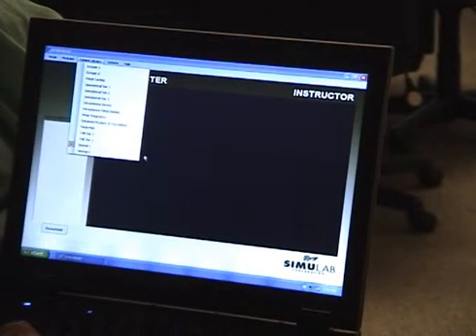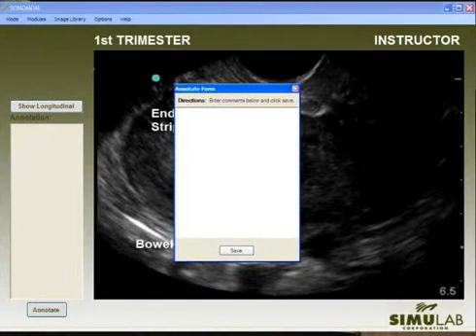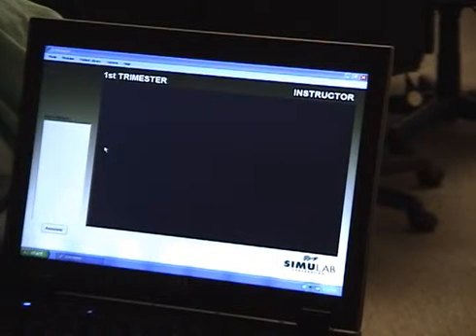You'll notice down in this area here we have an annotation mode. That allows the teacher to actually type in different descriptions or potentially a scenario that they'd like to identify in any one of the slides to start with, and all they have to do is press on annotate, and that holds for the slide that's being used. And that is of course described in the user's manual.